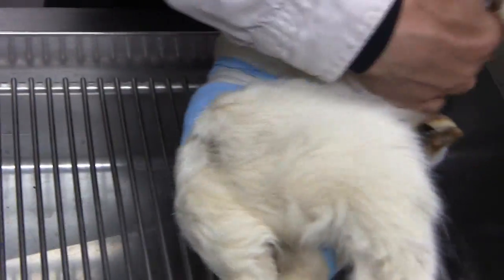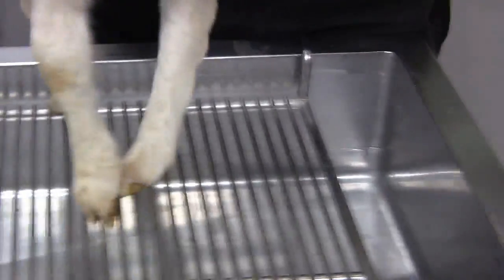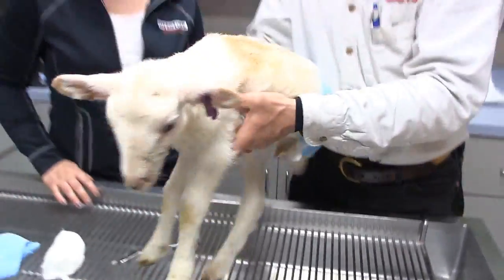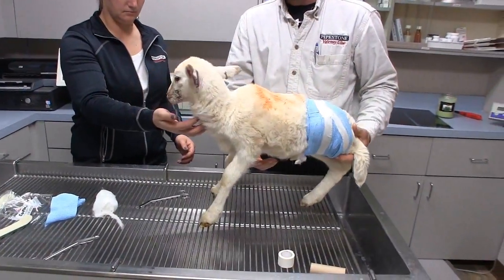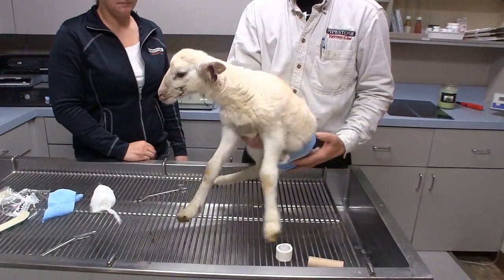And then the lamb, again, is going to take about 24 hours to kind of figure out how to hobble around on 3 legs. In many cases, these lambs will need to stay jugged with the ewe until that fracture is healed.